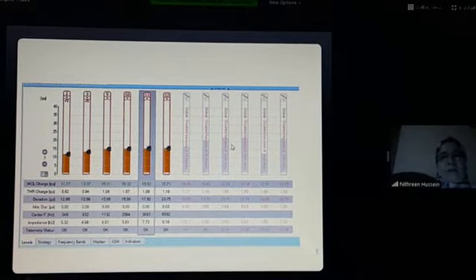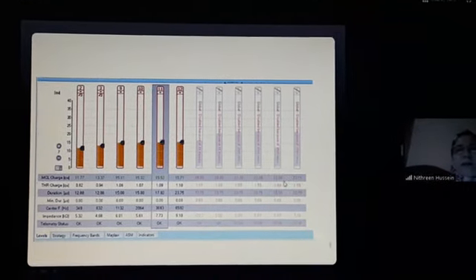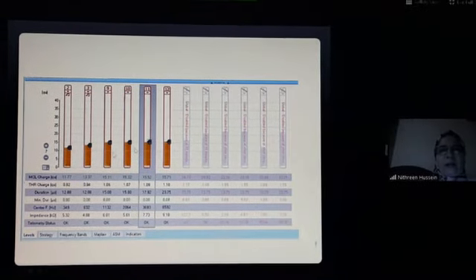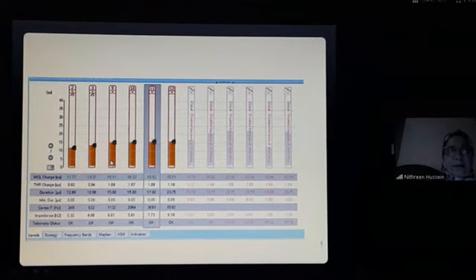This is an example of one of the patients who had a history of trauma, and we had open circuit at many channels, and we closed these channels, and the frequencies were redistributed to the remaining channels.